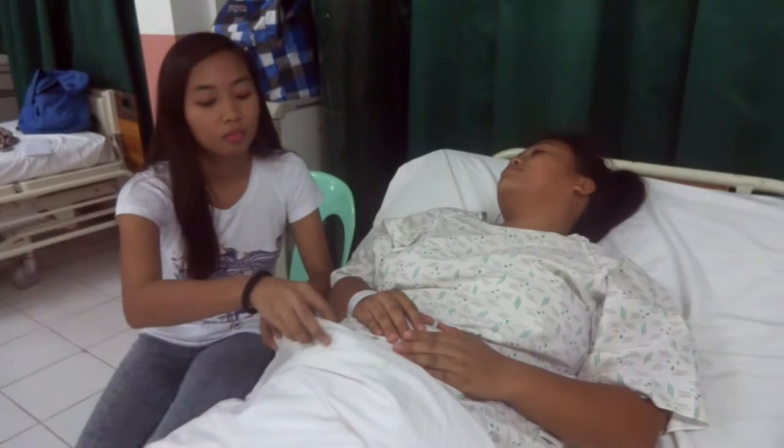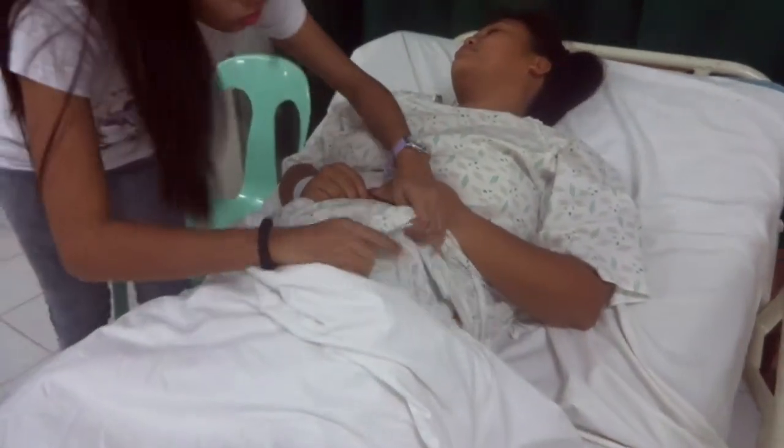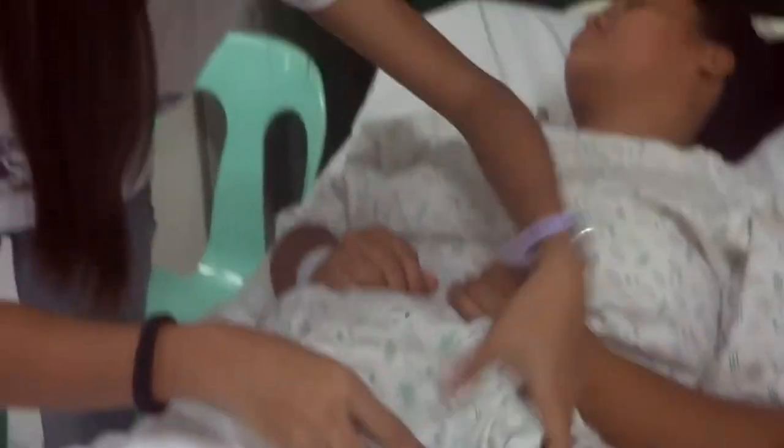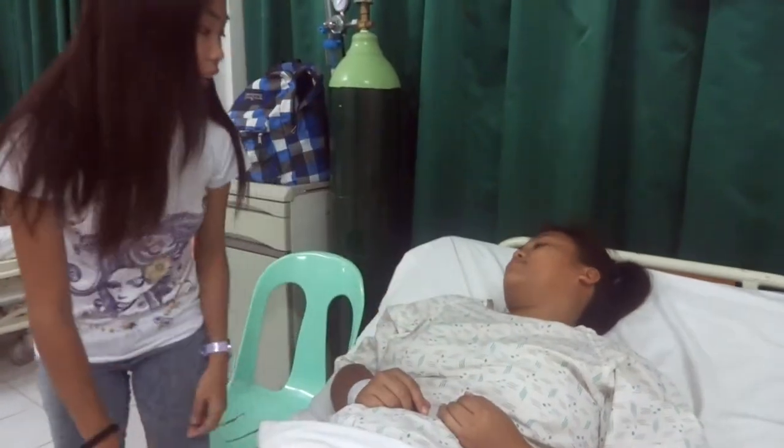Mom? Do you need anything? I think my colostomy bag is full. Is it okay if I check it? Your colostomy bag is full. I'll just go and tell the nurse, okay? Okay.